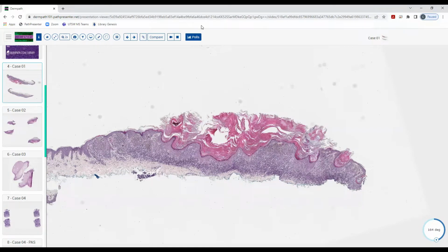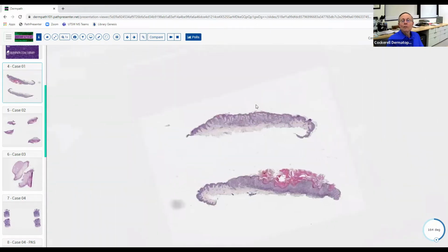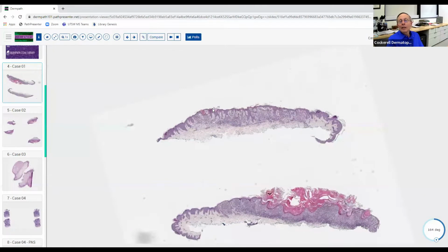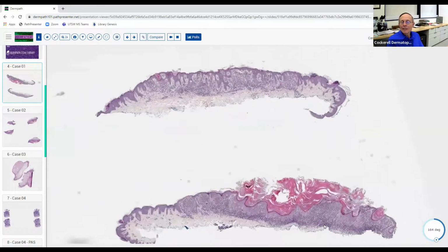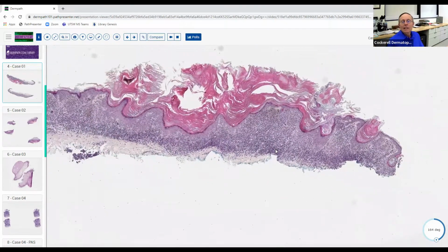Distinguishing this from regression of melanoma is still about the cytology of the nest and the configuration of the nest. In part, if, like you said, when you looked at low magnification, this thing looks pretty small, symmetrical, and well circumscribed. Regressed melanoma is almost always a broad zone, and you get what's called melanosis. You don't usually see quite the dense inflammation like you see here, interestingly enough. By the time you get a regressed melanoma, it's usually a patchy infiltrate of lymphocytes with melanophages and a loose, almost fibromucinous stroma that extends over a pretty broad front.